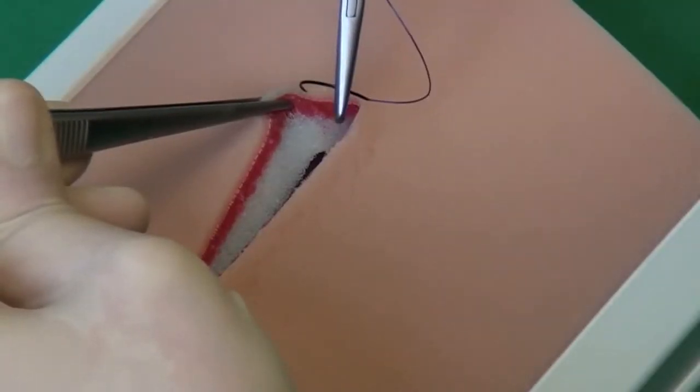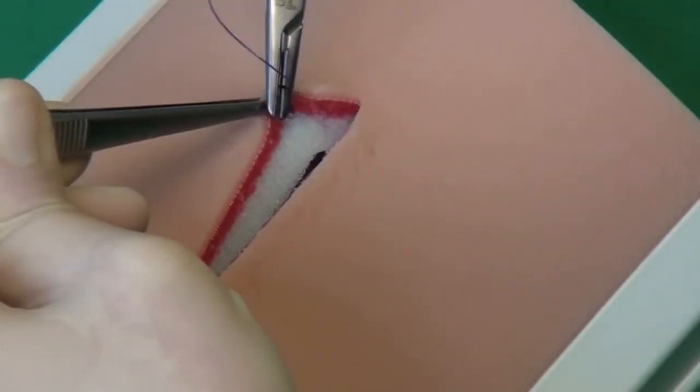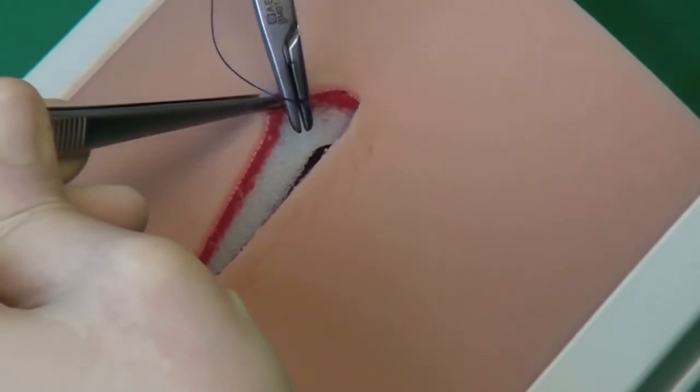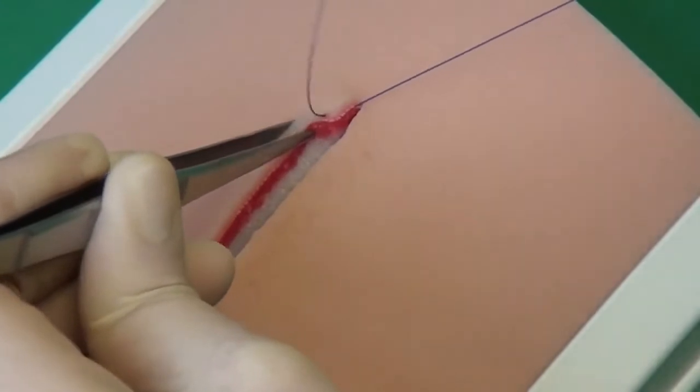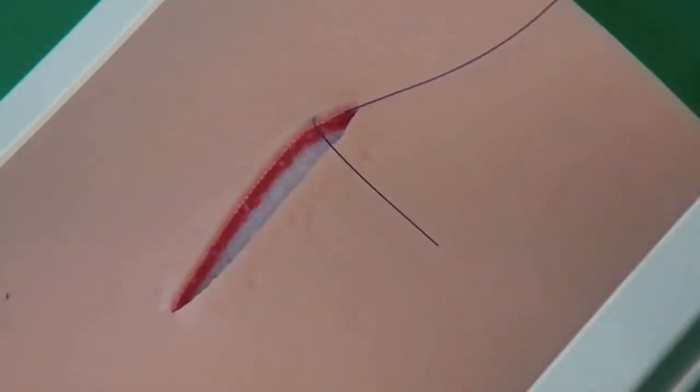The suture pad is used to simulate the skin. One starts with a v-shaped stitch, which is placed in the skin intracutaneously, just below the surface.